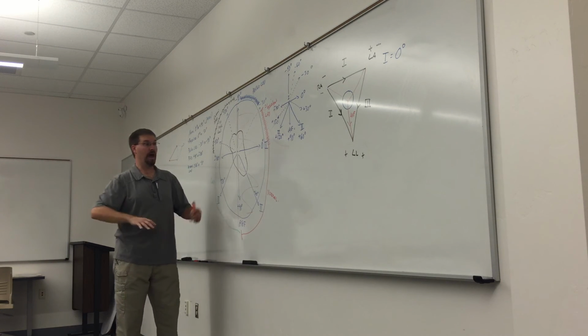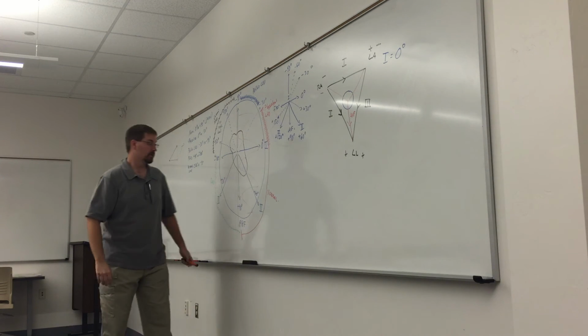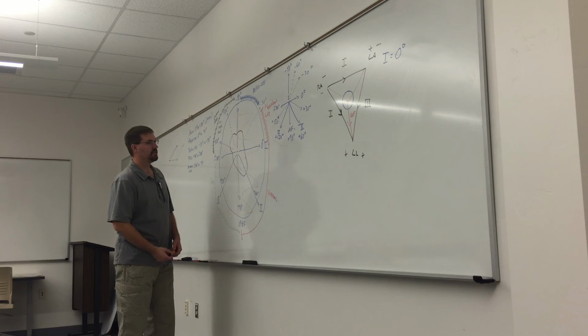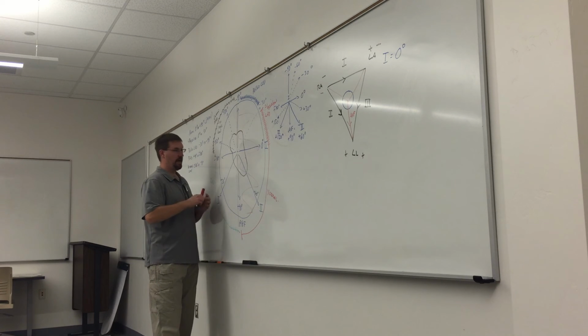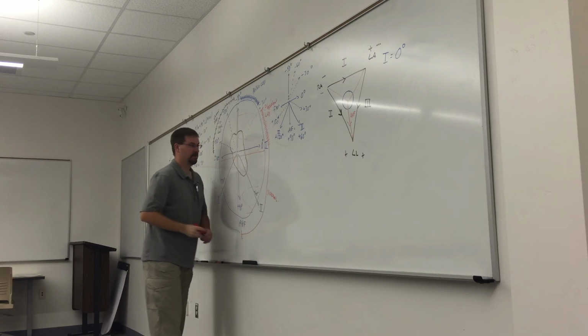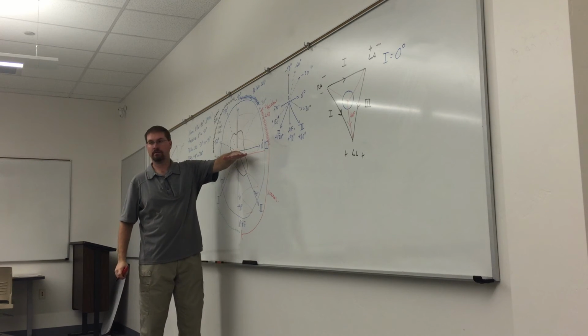Now I'm going to look at other leads and narrow the axis in. Let's look at lead AVF. What is a line that's perpendicular to AVF? The 0, 180. I'm going to draw that in red, right here. Again, I'm going to ask, is it positive or negative? Look at AVF.